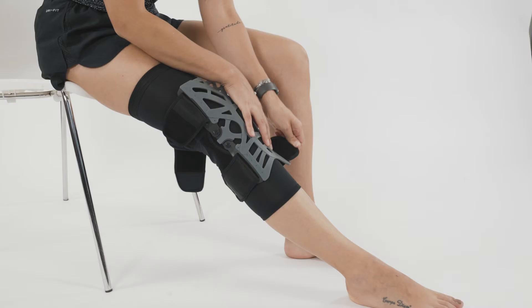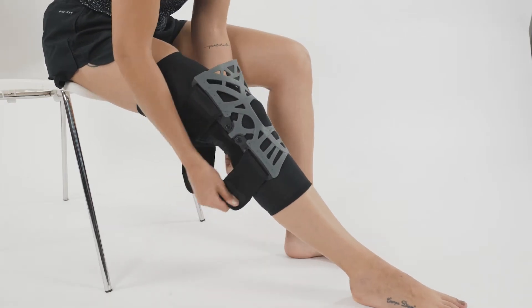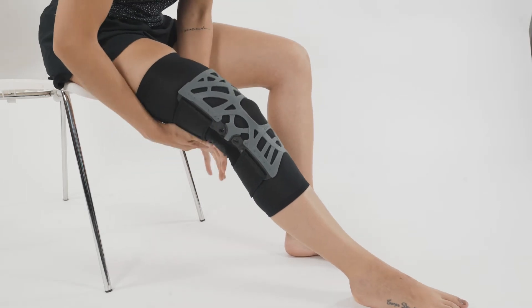The brace is a wrap-around design, which is really useful for patients that may have difficulty applying more of a pull-on or sleeve-type brace. It's also better suited for patients with a non-uniform thigh to calf circumference ratio.